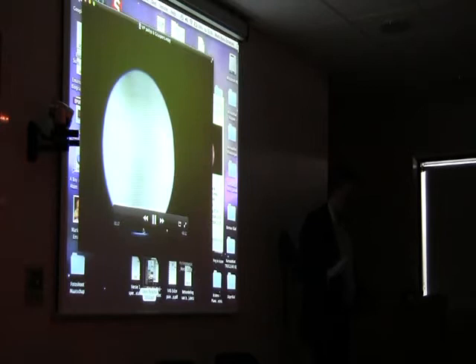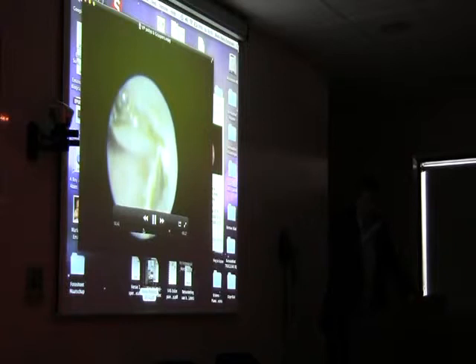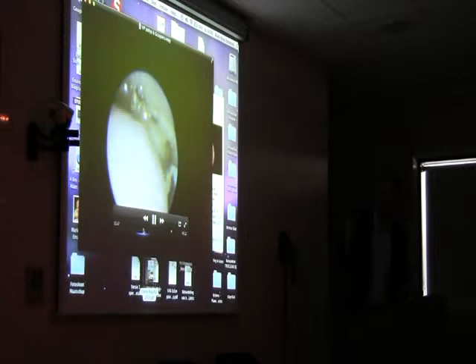Then you can burn the base to try to prevent recurrence. And then the only issue you have, and this is the key thing, and I think this is my new mantra actually, is what you were saying about the retained products. We should try and do everything under vision. It's a bit anarchic that we blindly instrument the uterus.